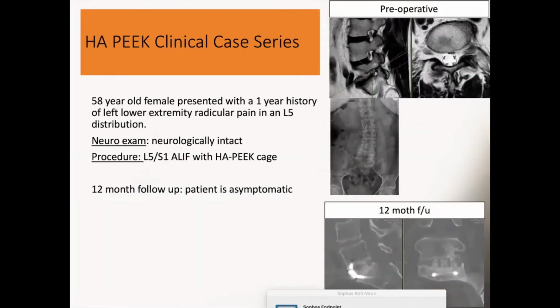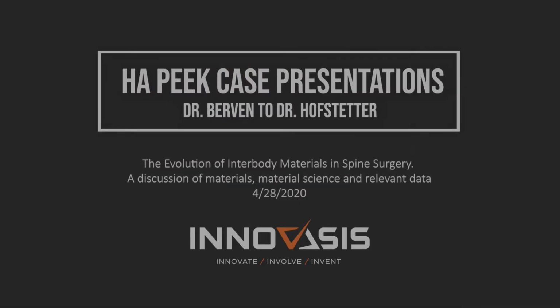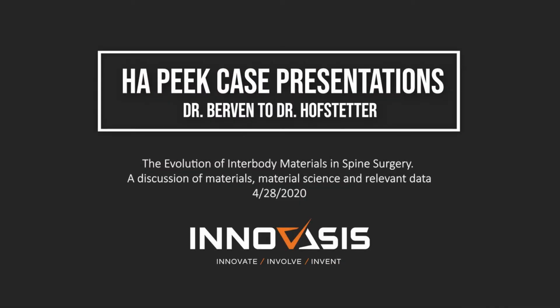Here's one lumbar case that I have right now. I just wanted to bring that up here. Here we have a CT scan in this patient too. A 58-year-old female, 1-year history. Again, I like to do standalone ALIFs. I think this is just, if patients don't have pars fractures, and it's possible, it's my go-to procedure there. And you can see the nice bridging bone there. Again, absolutely no halos, and a nice fusion that's a year out. So those are the 3 cases. Again, very straightforward cases that I wanted to share that we're collecting.